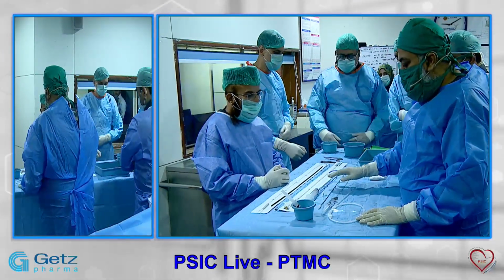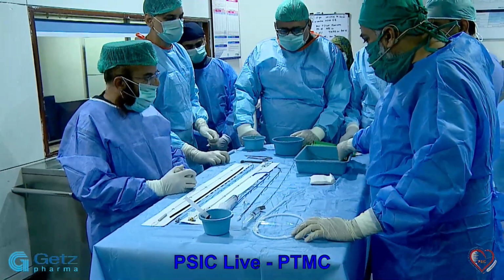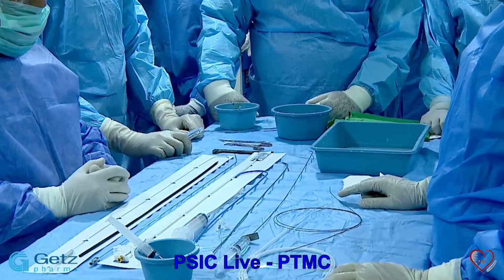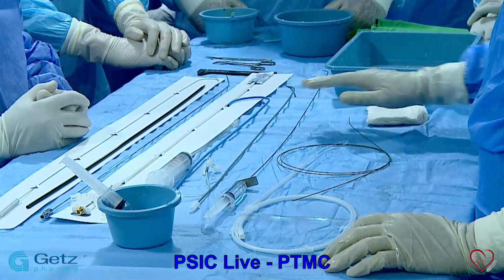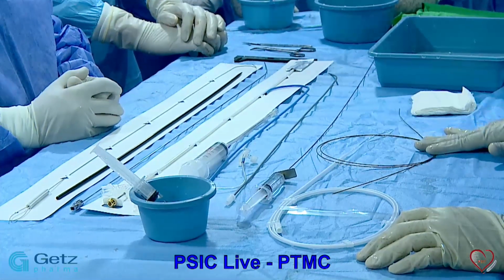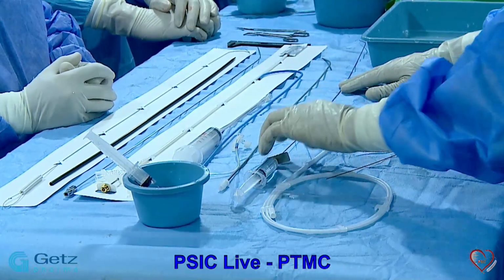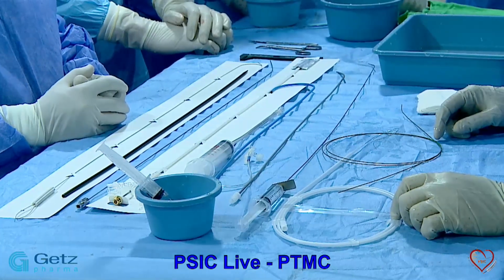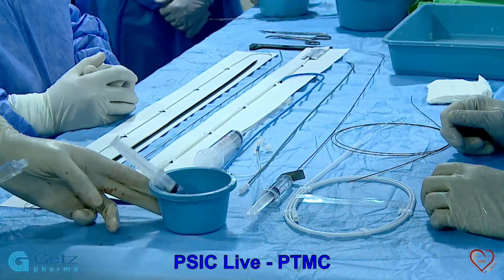First we'll take a 0.035, 32 wire. This wire will go to the SVC, and on this wire we will take the Mullins sheath in. The Mullins sheath will go with the dilator, and after this we'll take out this wire and take in this Brockenbrough needle. The length of the Brockenbrough needle is slightly longer than this dilator. This will help us in puncturing the septum.